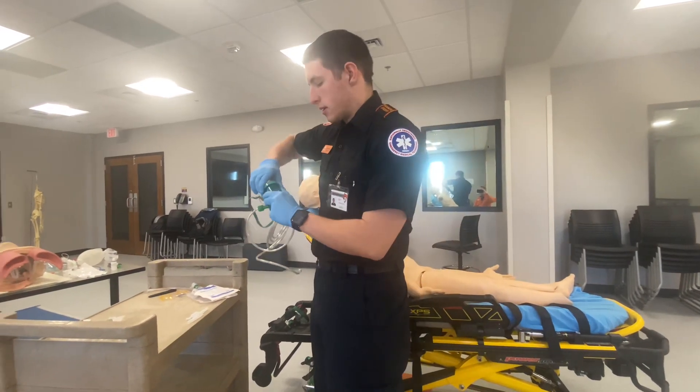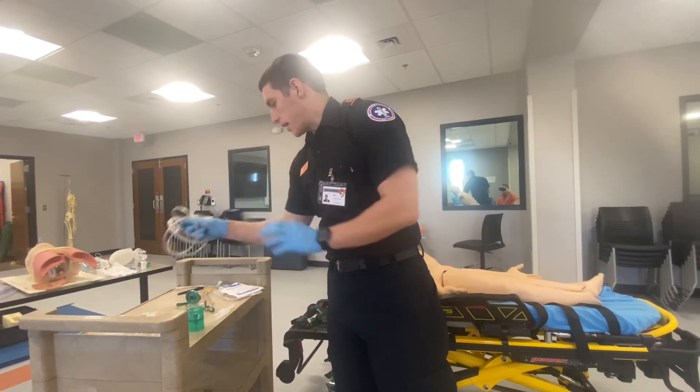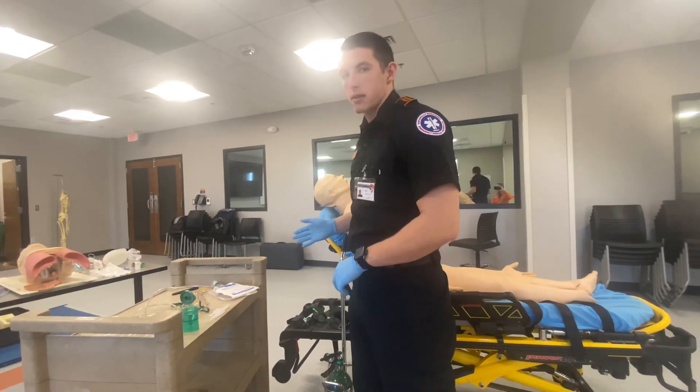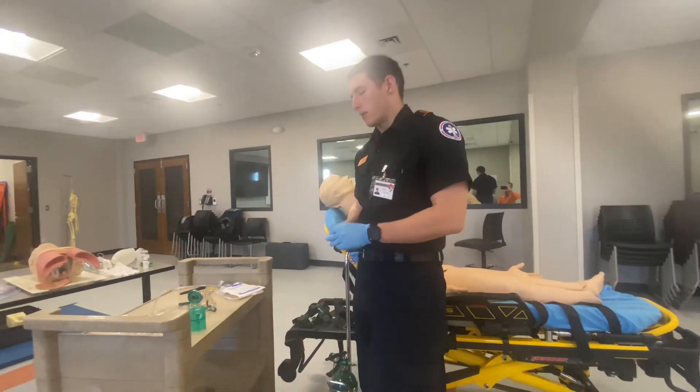I'm going to take this off and make sure that I have the five rights: the right patient, right dose, right medication, right route, and right time.